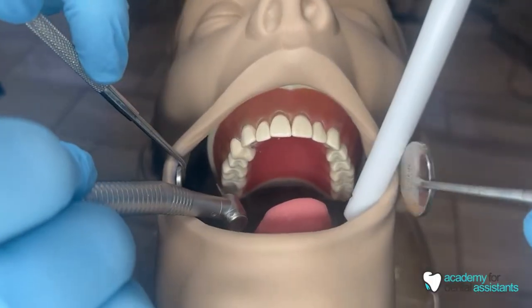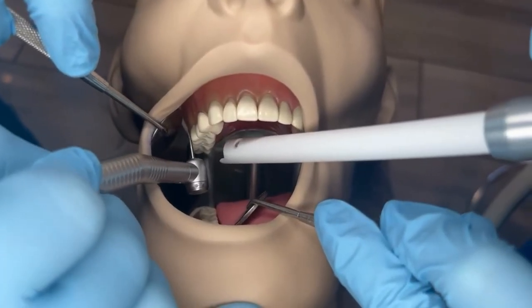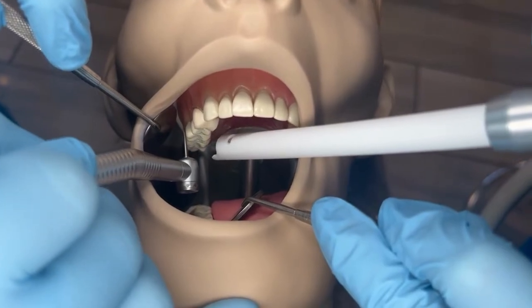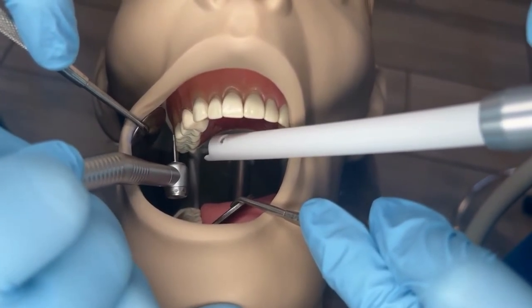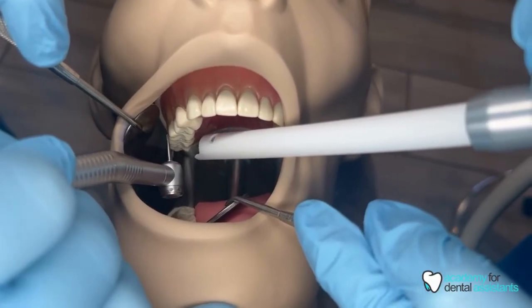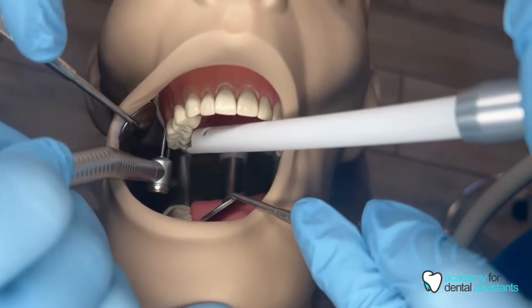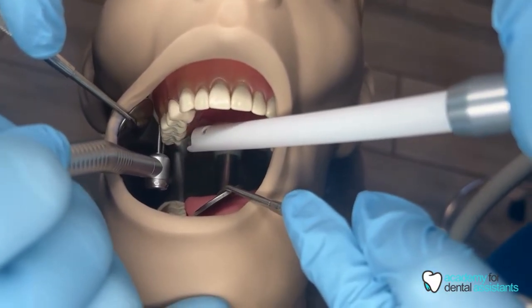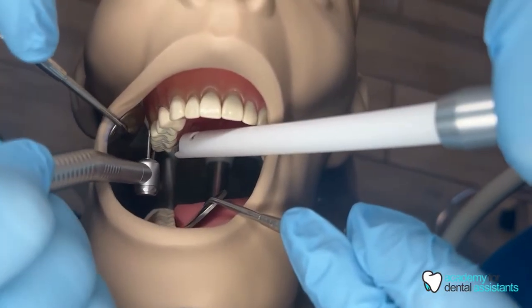We're going to start with the upper right. The doctor is working on the buccal of tooth number three, so as you can see the HVE is placed towards the occlusal lingual surface. You always want to make sure that you're using two hands — both hands at the same time — so you have your mouth mirror to retract the tongue if needed.